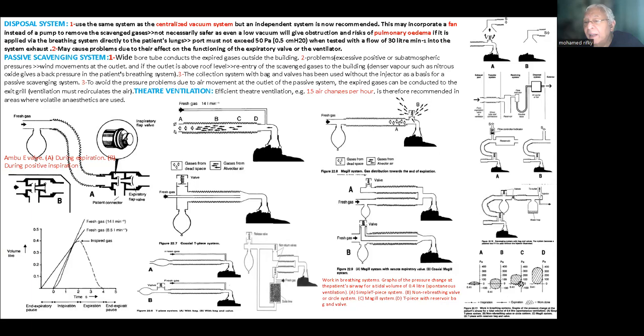And this is the resistance during expiration. Whenever I inspire 0.4 liter, I measure the resistance, and I can measure the work of respiration in different types of circuits, as we can see. And this is the zero line representing inspiration, expiration. So all this shows the resistance, whether it's during the period of inspiration or the period of expiration. It is a tough subject.